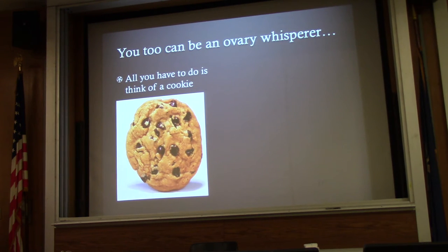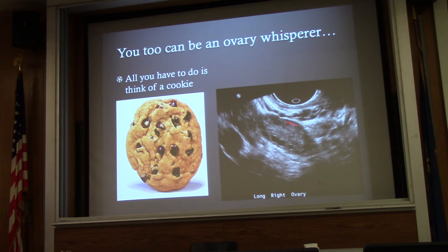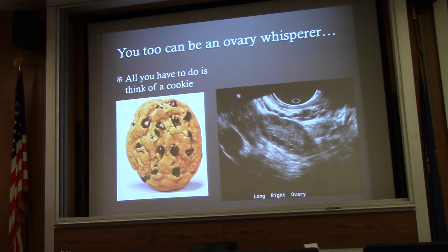You can be an ovary whisperer — all you have to do is think of a chocolate chip cookie. On this endocavitary ultrasound, you can see two structures: the ovary, which has a hyperechoic capsule, and the follicles. You also have an anechoic stripe — these are the iliac vessels. Iliac vessels are very important for localizing the ovary, because the ovary is always either medial and anterior to the iliac vessel.